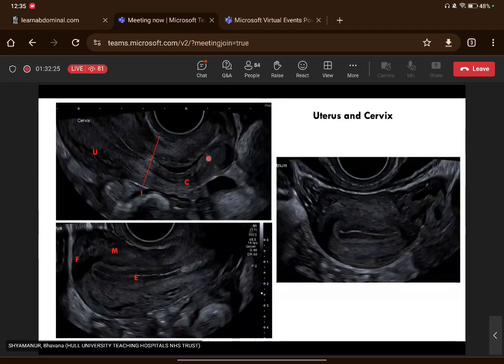So you can see gynecological anatomy really well with transvaginal ultrasound. So here is the probe sitting within the anterior fornix. So remember that's the little recess that's formed between the vagina and the cervix. So cervix here with a bit of fluid in the canal, and you can see that narrowing of the isthmus where the cervix then moves into the uterus.